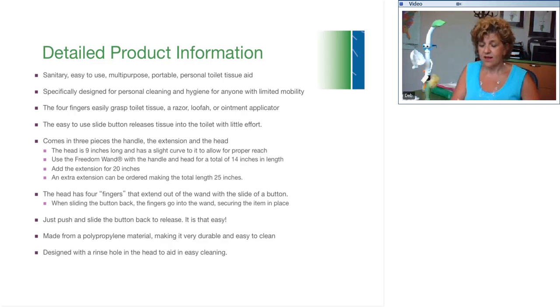Now, what I didn't think about is men. So men are also using this that have a problem with their shoulders. By taking it and just using the shortened part, they can shave their entire face. And by turning the shaver the other way around, they can actually shave their neck going up. Okay, so you want them to practice with this first and keep the shaver covered while they practice to make sure that they've got the right dexterity and that they can do that.